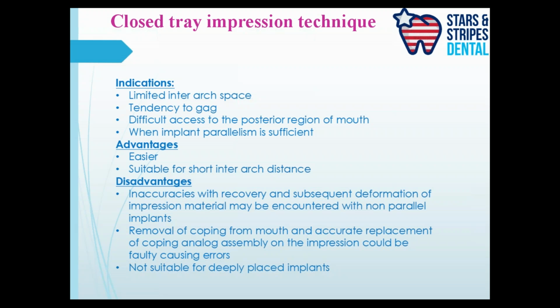Okay. One more limitation of this closed tray technique is if you're using it for more than one implant, it's good if the implants are parallel, almost parallel. Then this technique is quite accurate. But if parallelism is the issue, then it is better to use the open tray impression technique. Okay.